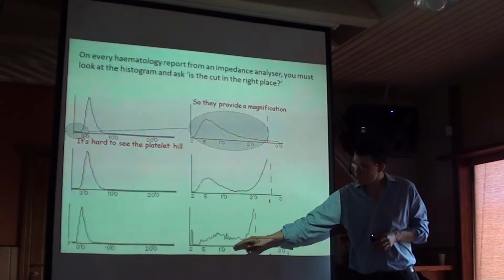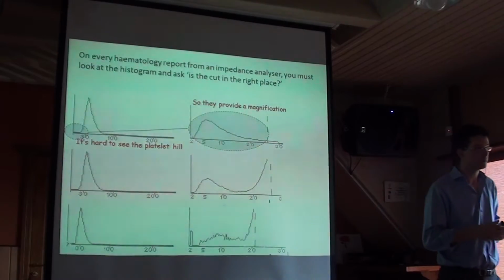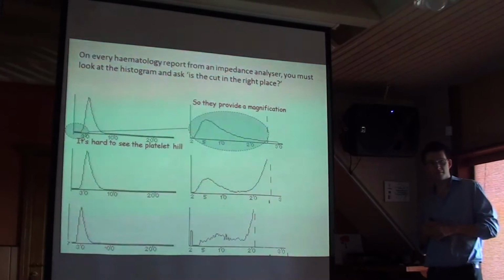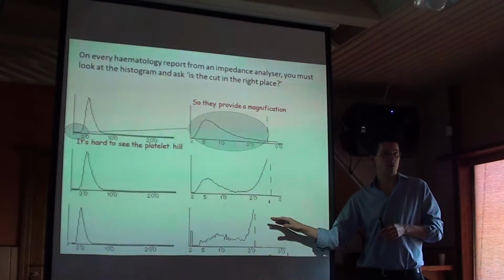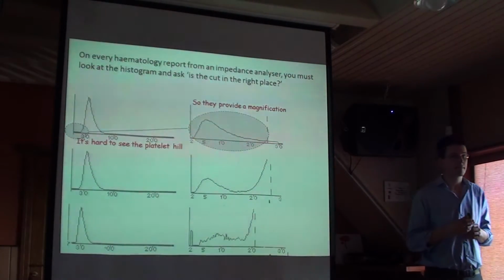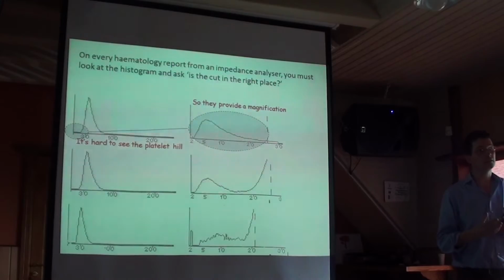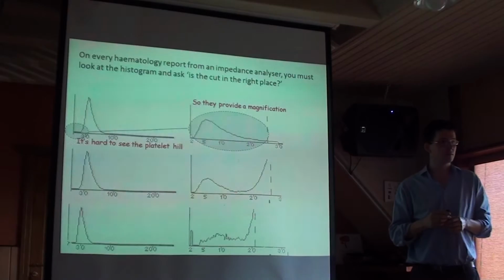Because it's not a smooth hill, the analyzer has been confused about where to put this line. Aga kuna see graafik ei ole nagu sileda pinnaga küngas, siis masin on jälle eksinud selle piiri tõmbamisel. So do you think the platelet count of the analyzer will be reliable? Kuidas teile tundub, et kas verelistakute üldarvu määramine on üldse usaldusväärne? No. No, we're going to see again overcounting. Et siin on jälle verelistakuid loetud rohkem, kui need tegelikult on.